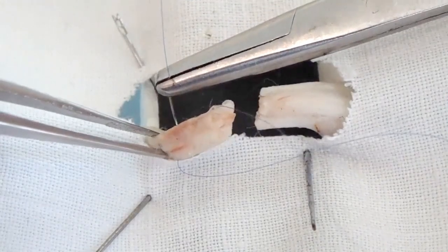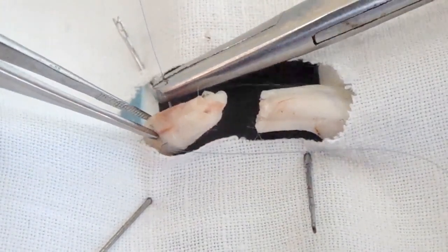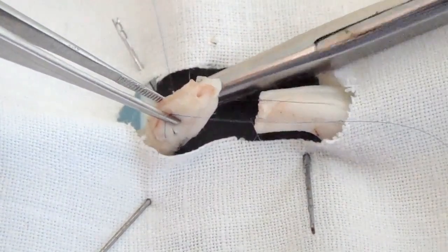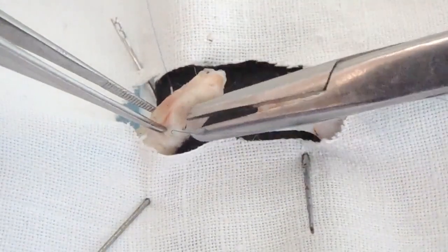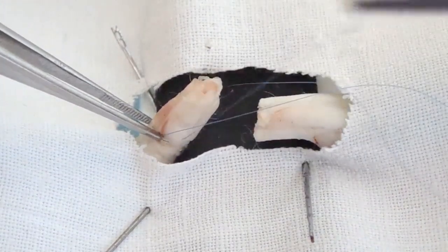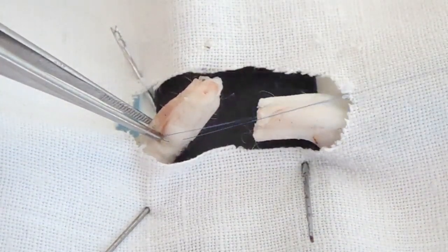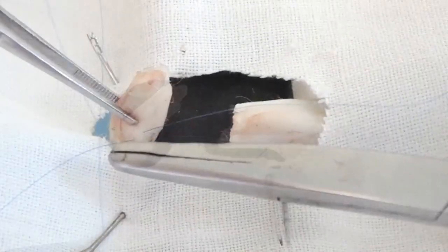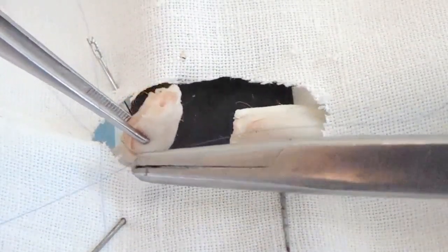The tendon is pierced with each needle alternately at an angle of 45 degrees. The sides of a needle input must correspond to the places of an output. This technique provides total implantation of the filament inside the tendon and makes a smooth sliding surface.